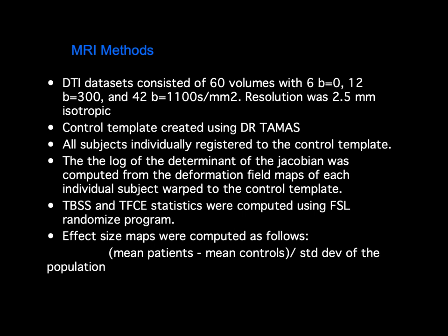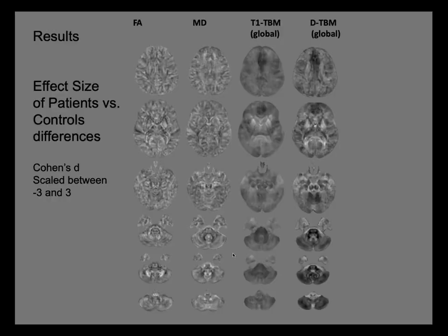We like it because statistics for imaging is a bit of a difficult beast, since you have to deal with multiple comparison correction with data that is not well behaved and so on. So sometimes you risk being too conservative or too relaxed in your strict statistical assumptions. These effect size maps give you a feeling of the magnitude of the difference divided by an index of variability. And these are pretty informative.